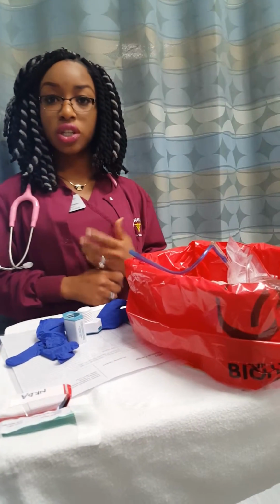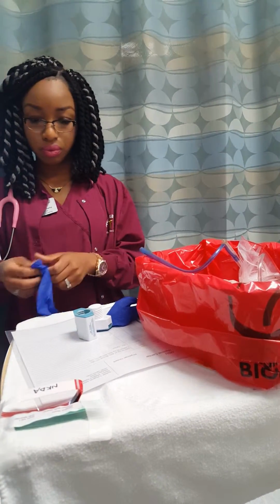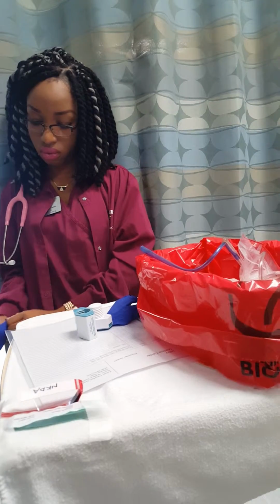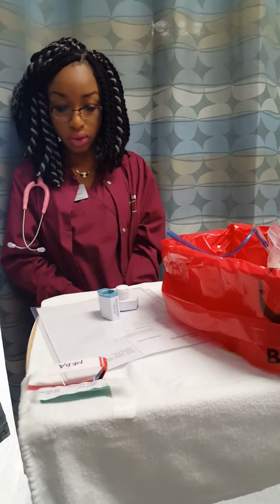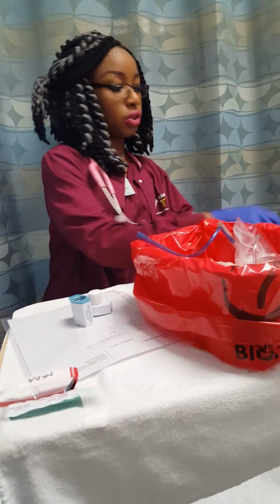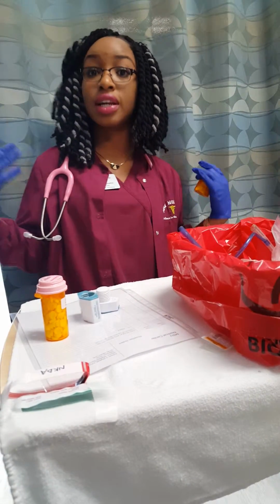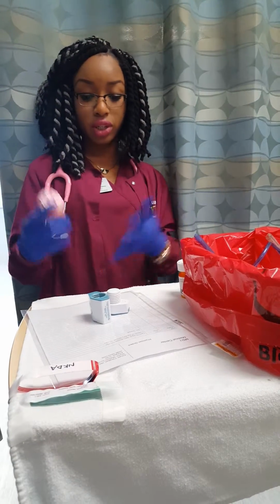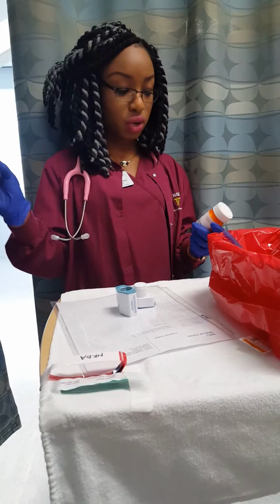And just to make sure the patient is all right, I am going to perform hand hygiene and put on my gloves. To make sure I provided privacy, patient is comfortable, patient knows what's going to happen. Alright, I'm going to give my medication, and I will also be making sure that the medication is something that I can crush, so it's not an extended release or enteric coated, because that is how I will be administering it. So I have my Lotensin, 20 milligram.